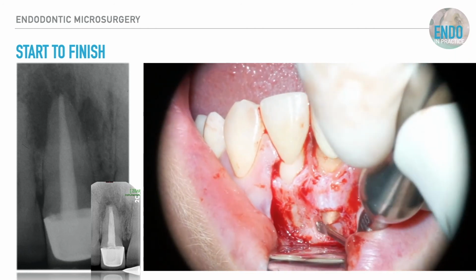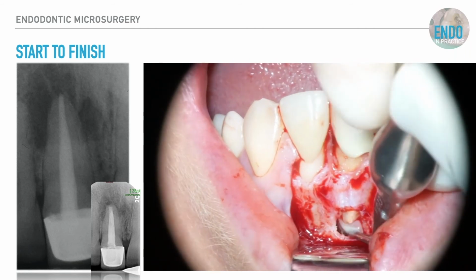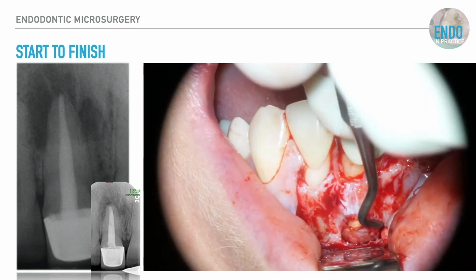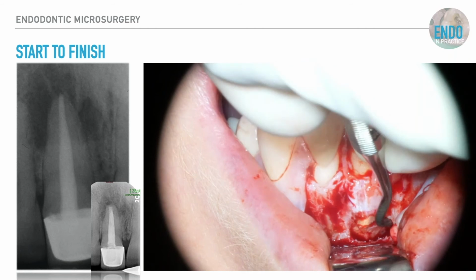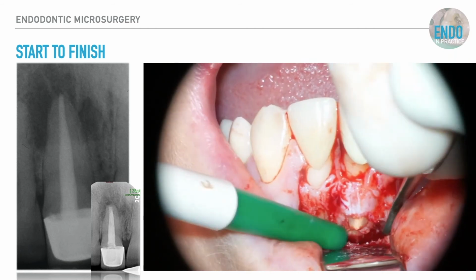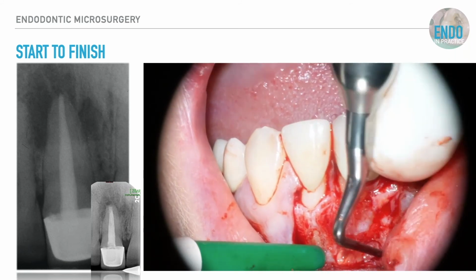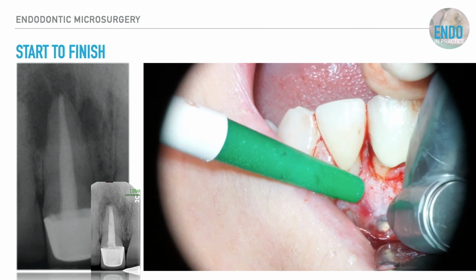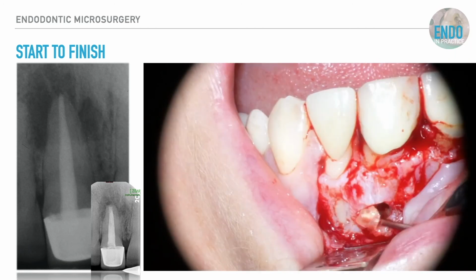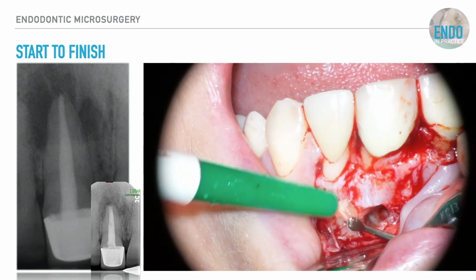So this is where, when you open up the crypt, not just immediately try and tear that soft tissue lesion out. It's like removing the lining of an eggshell. If you go around the periphery of it and gently detach it from the bony crypt, you'll have a much better chance of getting it out intact in one piece, and therefore reduce any bleeding later in the surgery. Now what I'm doing is I'm removing the apex, because that actually helps remove the lesion, especially if the lesion has tracked down the palatal aspect of it.